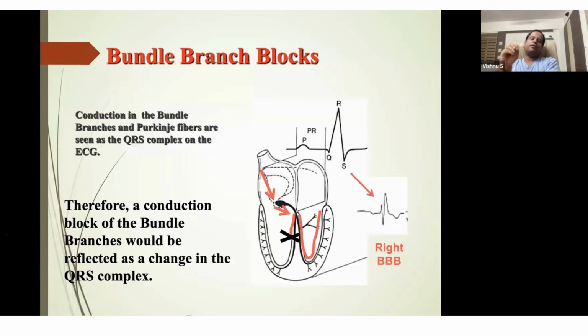The final part of the RV activation is from the myocardium, not from the Purkinje cells as happens on the left side. So the RV myocardium conducts to the RV anterior wall and base, then it will go to the outflow tract muscle. The first part is contributed by the left side of the heart, but on the right side it will be much delayed and the voltage will be so big that we get an M pattern in right bundle branch block.